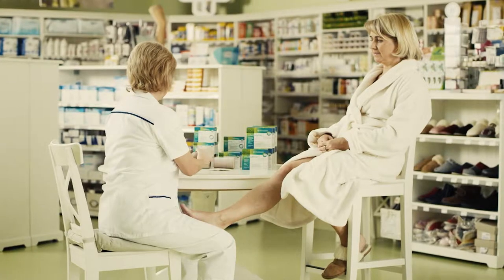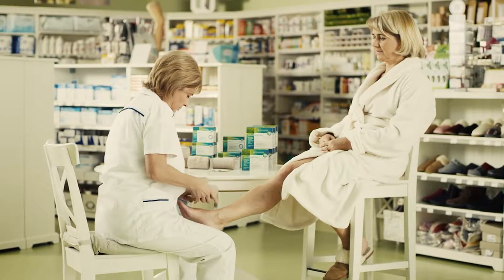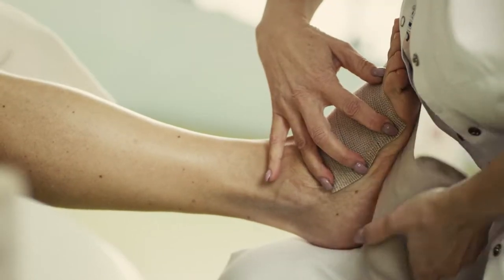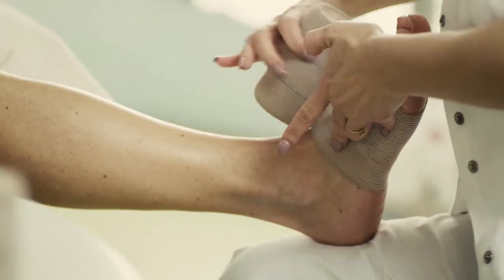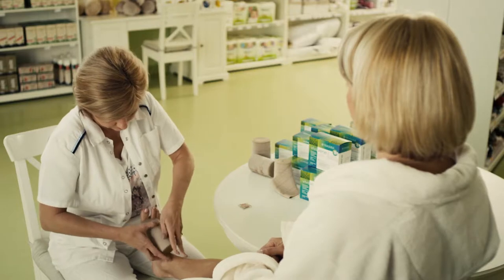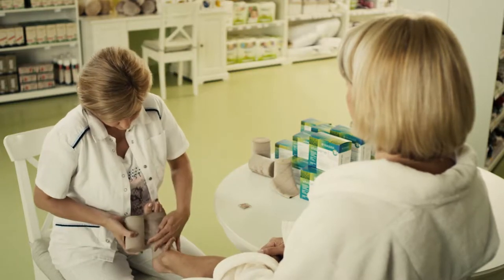Always put a bandage on from bottom to top. Start the first wrap right at the toes, on the outer side of the instep, so that the edge of the bandage will not disturb when walking. Each subsequent wrap should reach a maximum of one-third of the bandage across the lower wrap, which means that the lower blue line on the bandage must be covered.